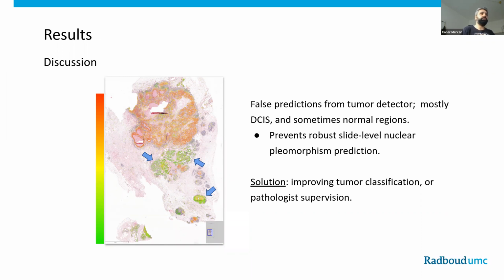For example, this slide would be graded as something like 3 in the traditional 3-category classification, but because of these false predictions, it was graded as 2. I saw this problem in just 2 slides out of the 118 slides, which was a big problem, as the overall grade of the slide was 1 grade lower than it was supposed to be. So even just correcting these 2 slides increased the kappa scores even more for AI.